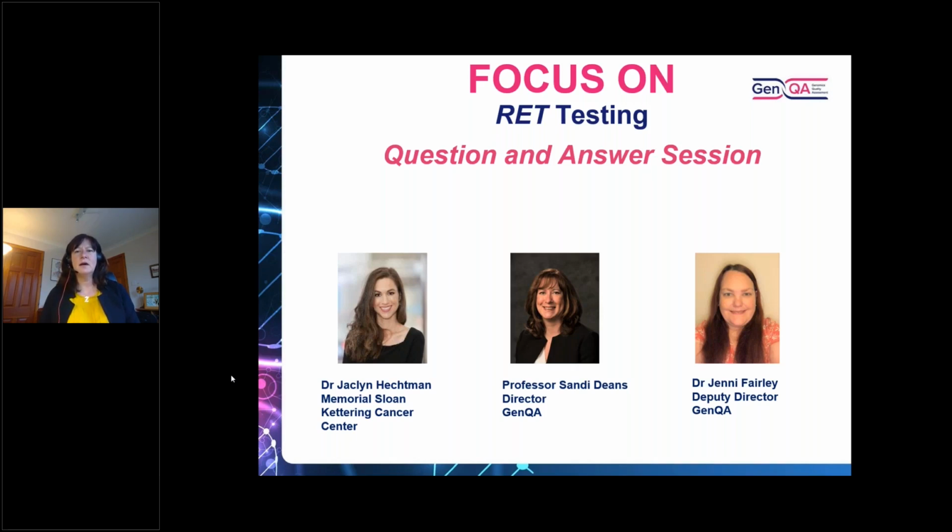Great, thank you. And I guess, Jenni, you see different approaches and content on reports through the EQA scheme as well, from the many labs that participate? That's right. One of the things we always think is quite important, if you don't find anything, is to make it clear what testing you've actually done. Sometimes it's not very clear that there might be other reasons why you haven't picked up something in your sample.